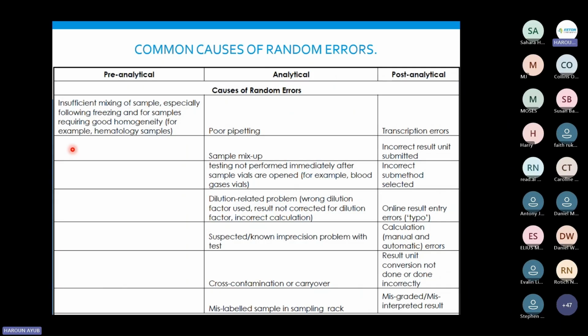Remember the water also that you are using in reconstituting. The ideal, as we usually say in laboratories, is to use deionized water. You can just get a 5-liter tank and put it in the lab. So despite them buying distilled water for you, just have a deionized water, 5-liter, put it separately for reconstituting your QCs or your calibrators or your EQA. Because usually the issues that come with calcium failing, potassium, sodium, chloride, all these ions, usually you're using distilled water.